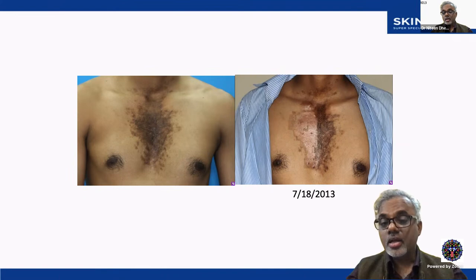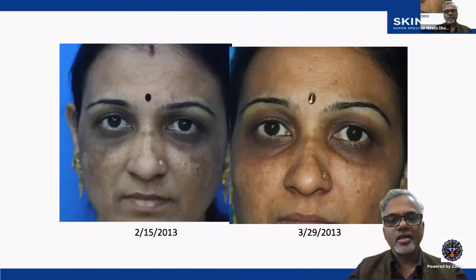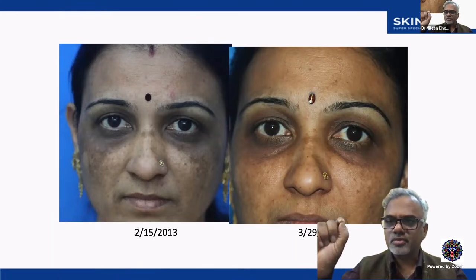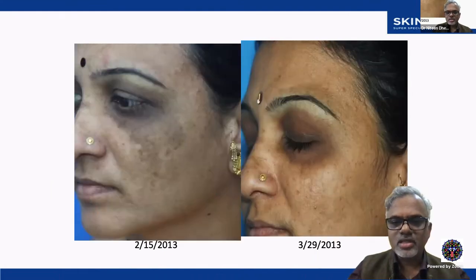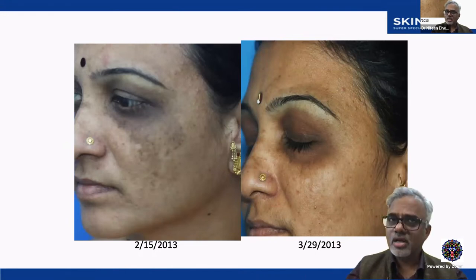And you can use this only when you master the physics, because I know here what works best. Again, for the pigment, people use a pigmentary laser. In Indian skin, if you treat this with a pigmentary laser, you get white spots. You get depigmentation, you damage the melanocytes. Without damaging the melanocytes, I use the dye IPL or the vascular IPL here, and that gives a nice clearance.